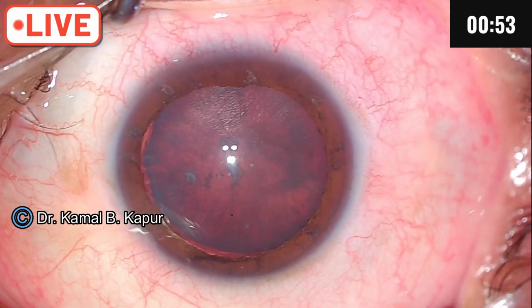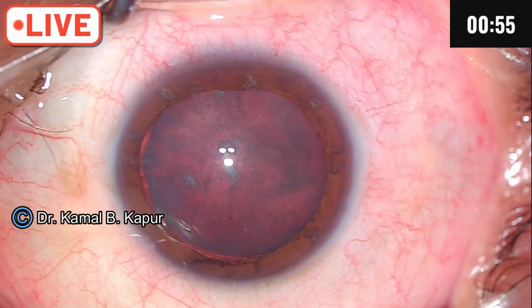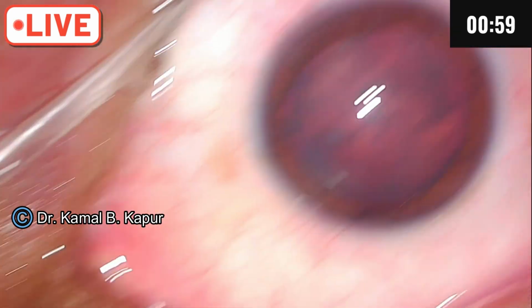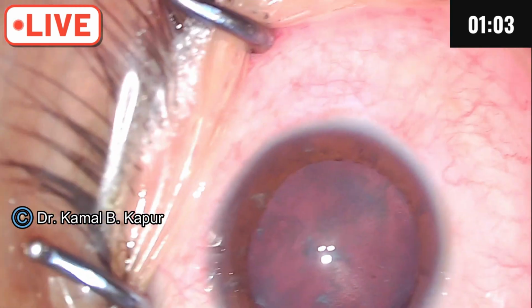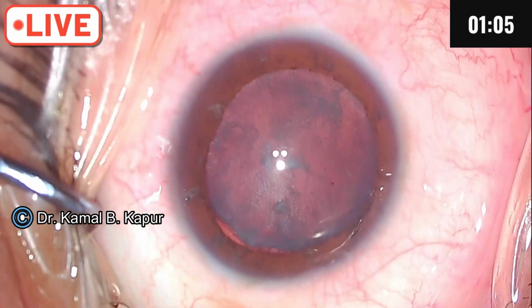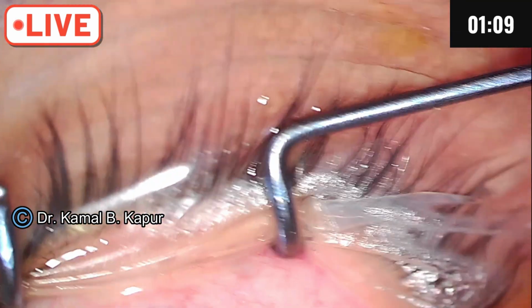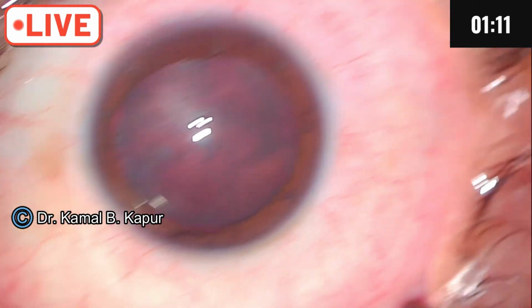Okay. So we will proceed. I have shifted. I was initially planning to operate it from the temporal side, but on seeing the subluxation in my area of working, I have shifted the position of working to superior.